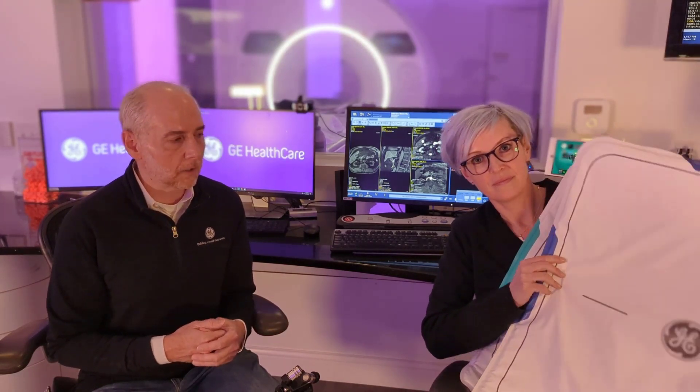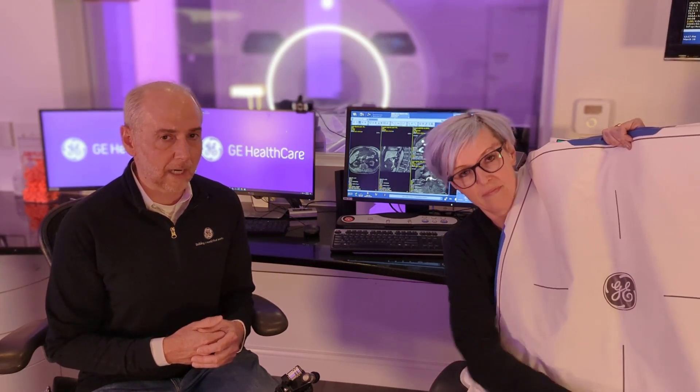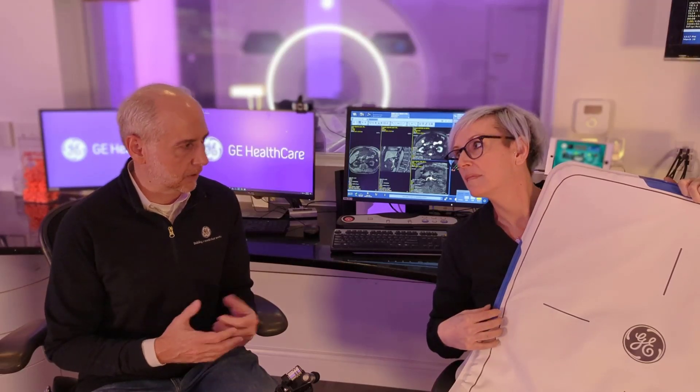A few other things you may have noticed about these coils. We have an easy identification color coding that goes along with the coils — you'll notice all the coils will have their own color. Also on the coils, we've identified them by the channel count, so that could be another way technologists could identify the coil. You'll also notice lines on the coil, which gives you an easier way to position your patients and wrap the coils around them.